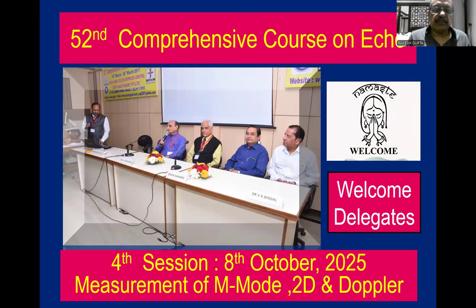Today we are going to deal with M mode and 2D Doppler measurements. I'm going to make it in two parts. Part 1 today will be M mode and 2D. And then subsequently we'll have the Doppler part separately, because we felt a number of times that we are lacking in this particular subject.